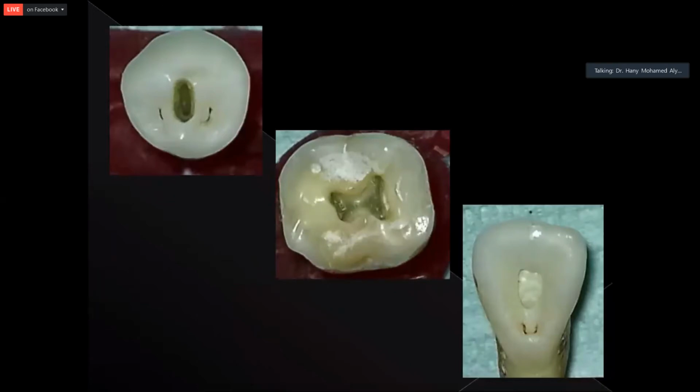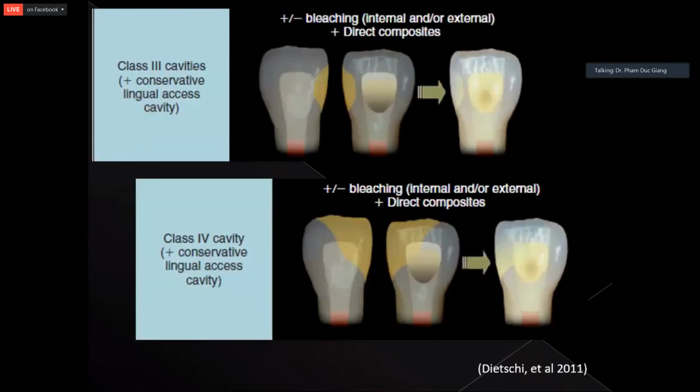A post also is not indicated if there is a tooth scheduled for RCT in a class 1 or there is a very minimal loss of the tooth structure. This also is not indicated for any post placement. Tiếp theo là cái việc đặt chốt, bên cạnh là ở những răng quá nặng thì những cái răng mà nó gọi là quá nhẹ, những răng có cái xoang mở tủy kiểu như trên hình ấy, thì những cái răng này mô răng nó không bị mất nhiều, cho nên là chúng ta không cần phải đặt chốt.